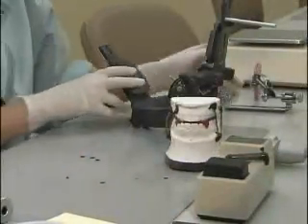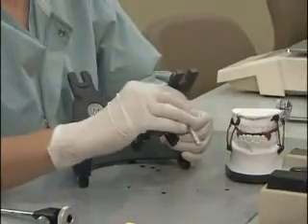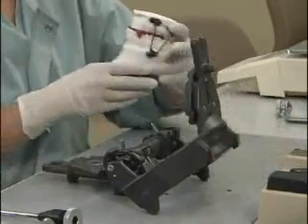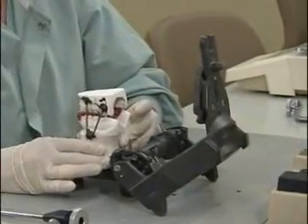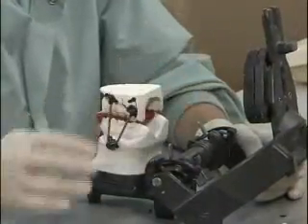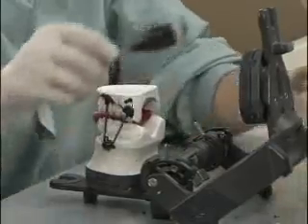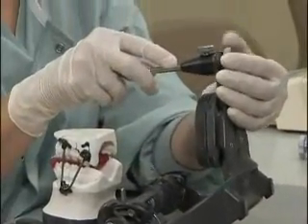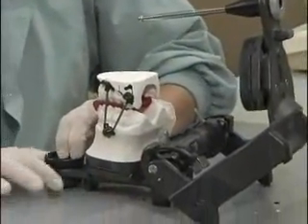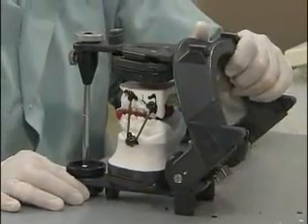Now place the models back on the articulator. Place your pin and your incisal guide table. Now you can mount the lower model as you did the upper, as previously described.